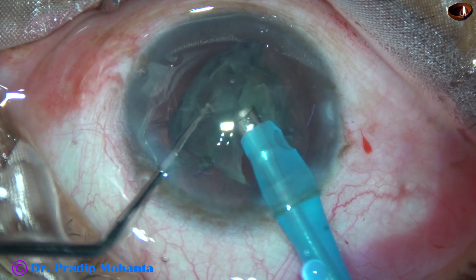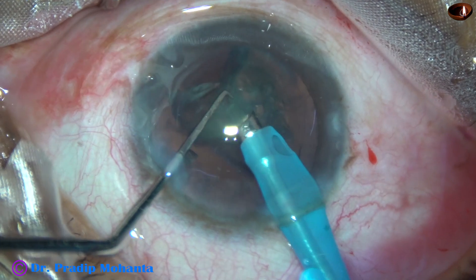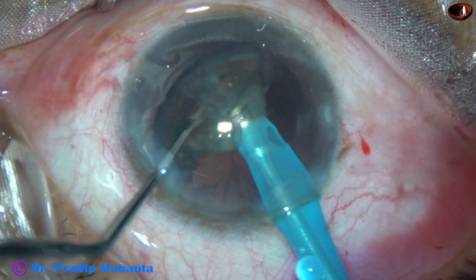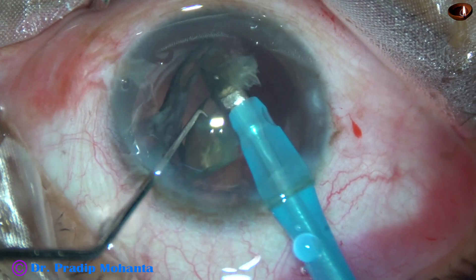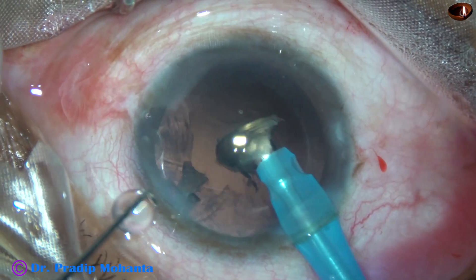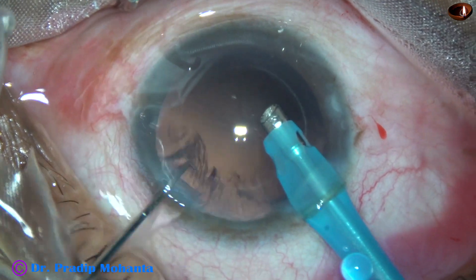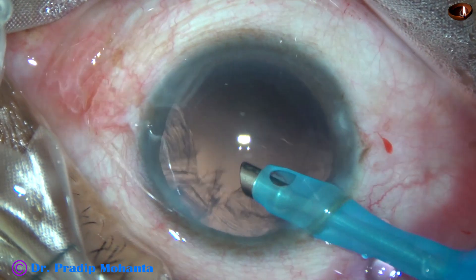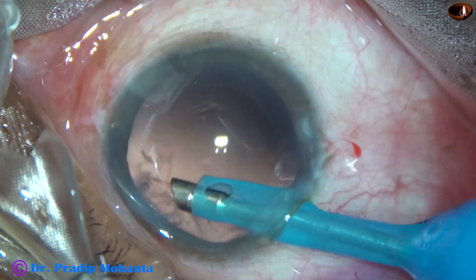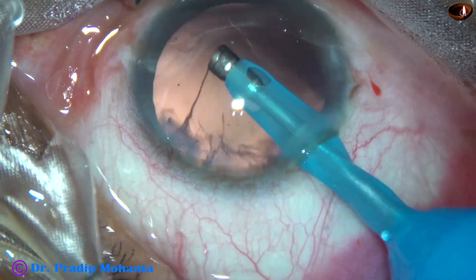Always set the energy according to the hardness of the nucleus. In this case the ultrasonic energy was set at 60%, though 60% energy was not required most of the time. During the last part, go to epinuclear mode where the vacuum and flow rate are also less. Initially don't try to aspirate the cortex by the FACO probe itself — this is not for beginners.